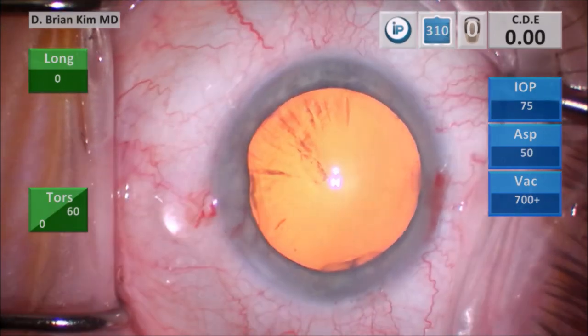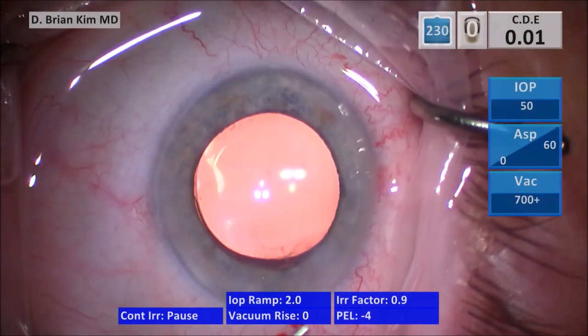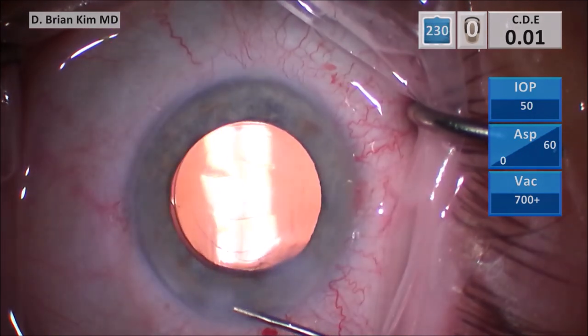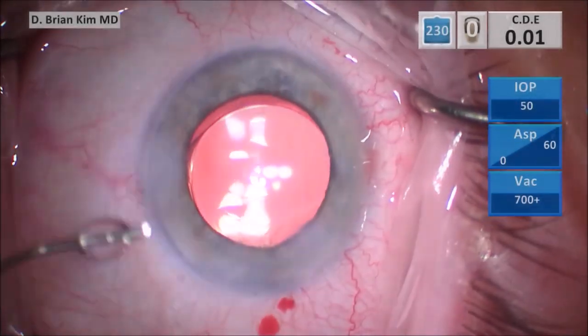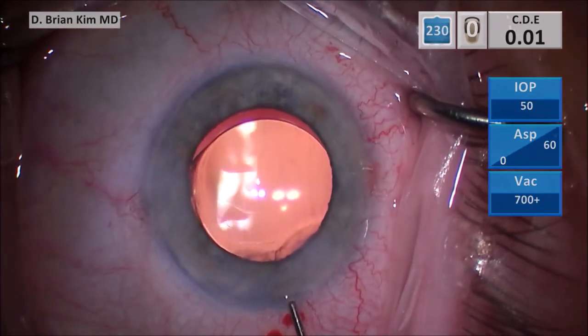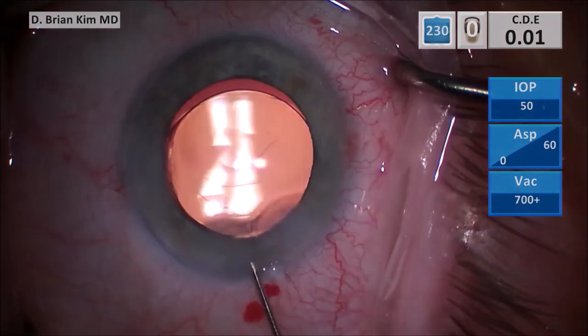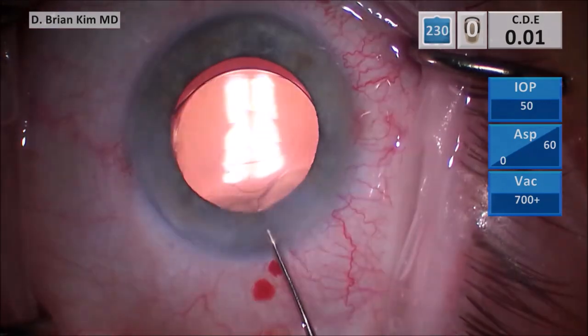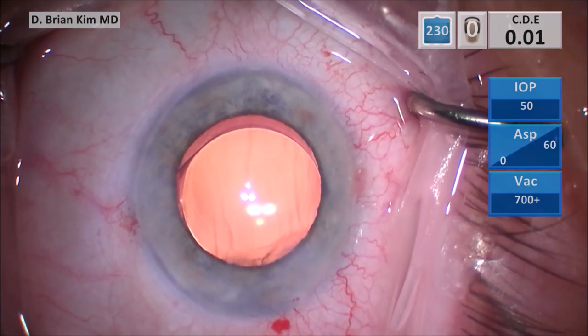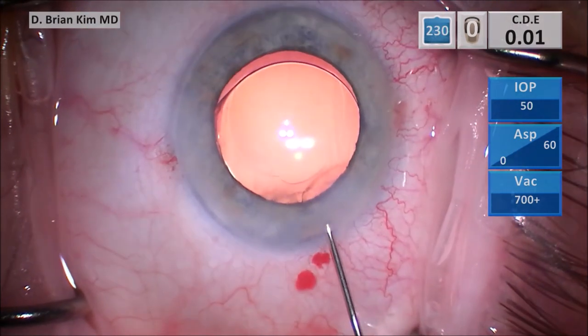I'm going to hydrate my incisions — hydrating the sides, the right and then the left. Sometimes hydrating the roof is a little bit tricky. You want to angle the cannula tip a little bit more upward and into the actual meat of the stroma of the roof, then gently hydrate side to side. You never want to be too vigorous because you can actually separate Descemet's membrane, so it's very important to be very cautious.